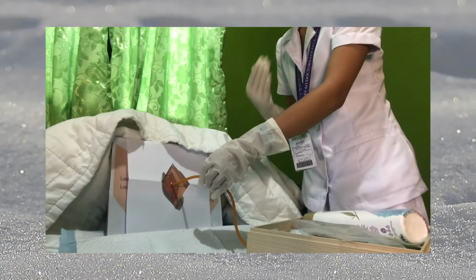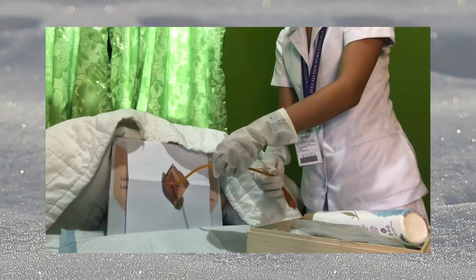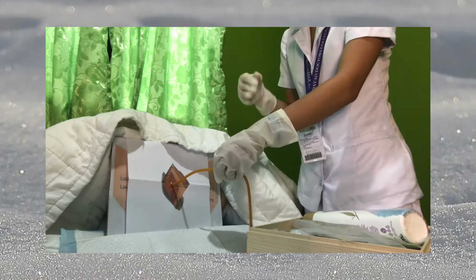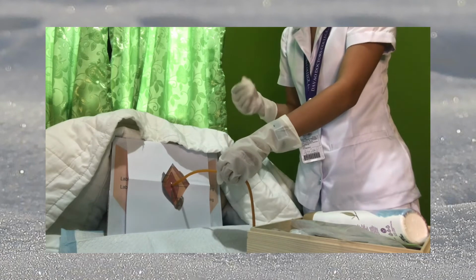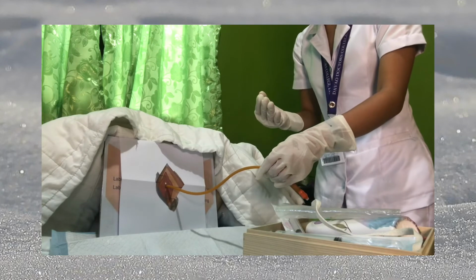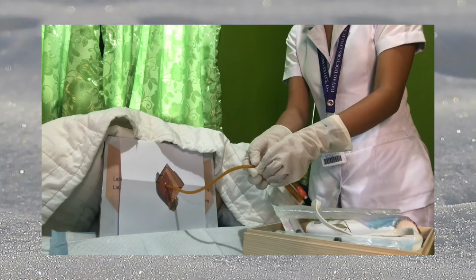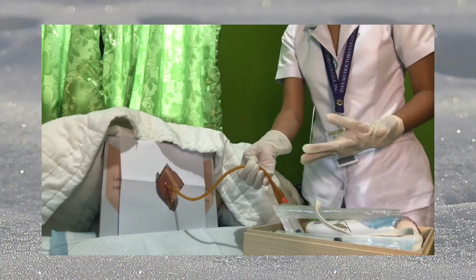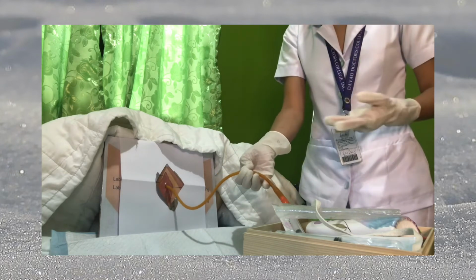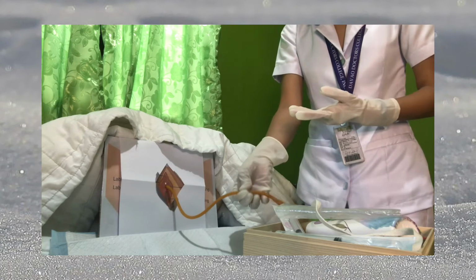Then, if a specimen is to be collected, pinch the catheter with the thumb and finger while placing the specimen container in position, because urine will flow out of the catheter if the lumen is not occluded. Now, rest the hand on the pubic area while holding the catheter in place to prevent pulling and pushing of the catheter. Withdrawing the catheter and pushing it back into the urethra increases the possibility of contamination of the urethra.